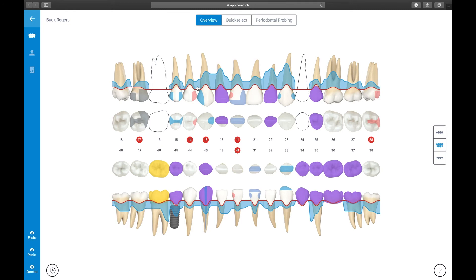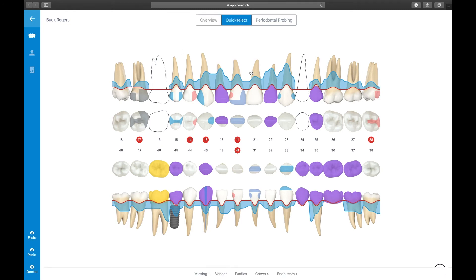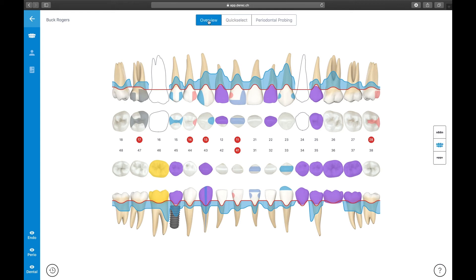Let's focus on endodontic diagnostics. Endodontic findings can either be entered via the Quick Select function or through the single tooth view. Full endodontic diagnostics require mostly three clinical tests: the cold test for checking the tooth pulp, the percussion test for testing the periapical tissues, and an x-ray of the tooth under investigation. To make your life easier, we made Derek so smart that it will suggest the endodontic diagnosis of a specific tooth to you based on the entries you perform on these three tests.